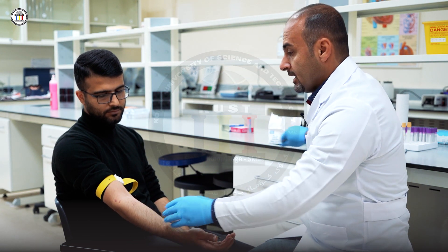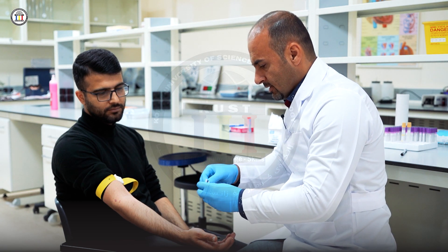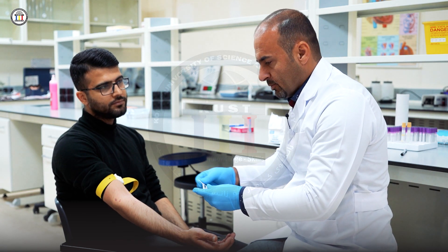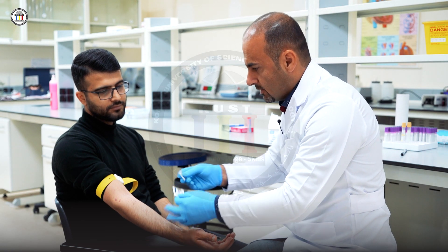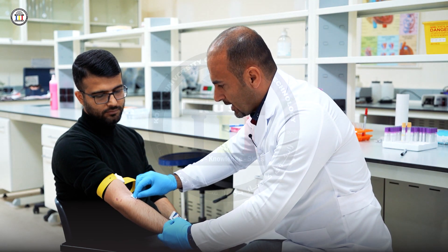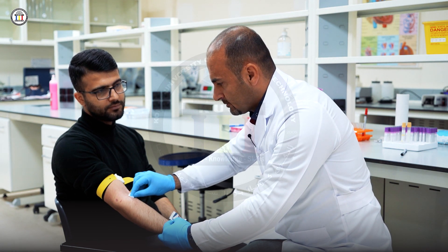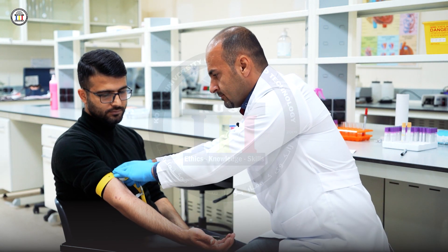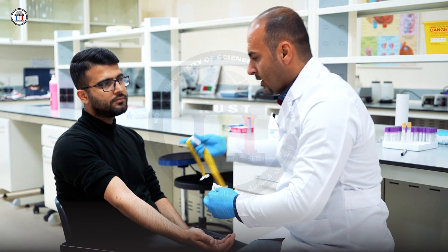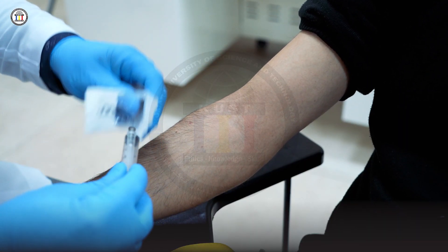You have to use an antiseptic — we have different antiseptics, but normally you can use an alcohol pad. Clean by a circular motion, just like that. After cleaning the puncture site, remove the tourniquet and wait about 30 to 60 seconds for air drying.